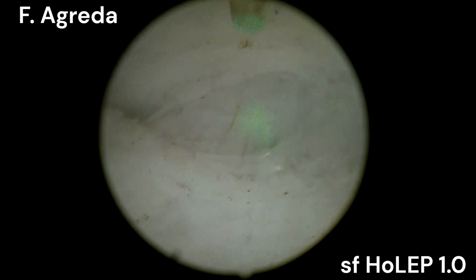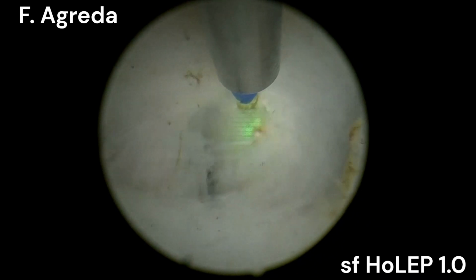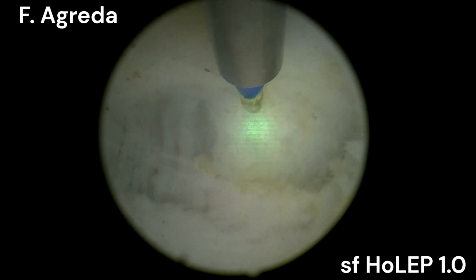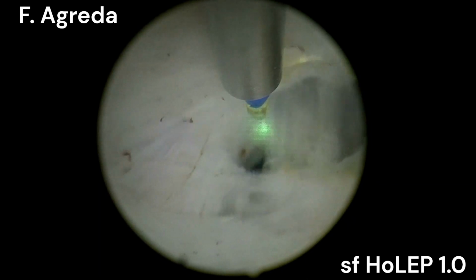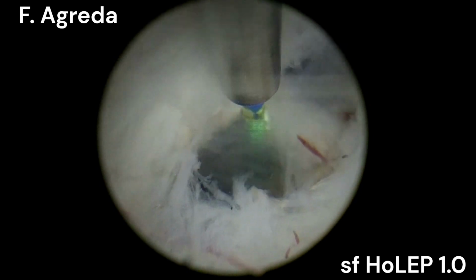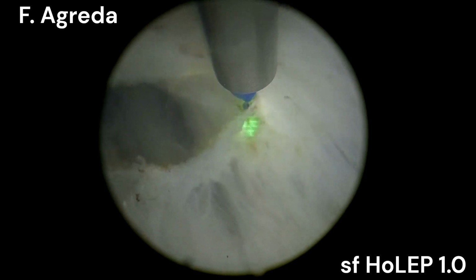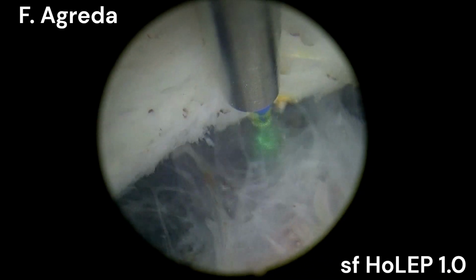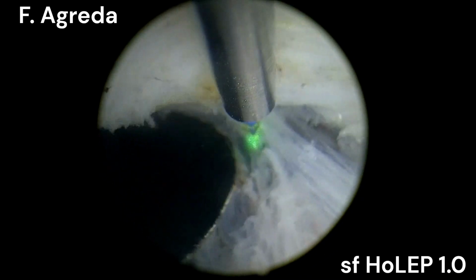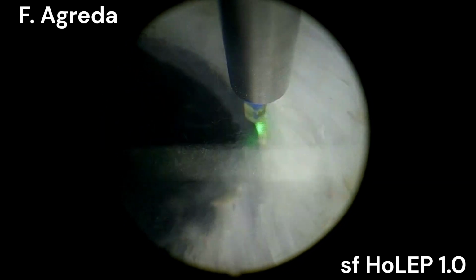As we can see here, we're almost at the bladder fibers. You can see vertical fibers here. We cut through them and we get to the bladder. It's black, that's the bladder. We cut the prostate cervical, very open. Here it is. That's the bladder mucosa, cervical mucosa, and we are in the bladder now.